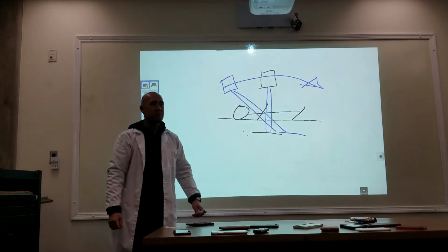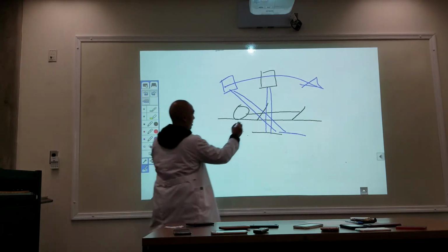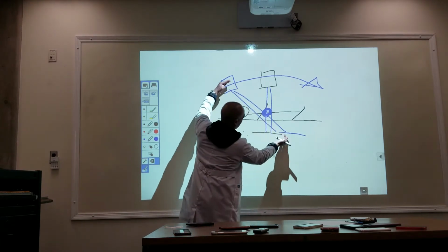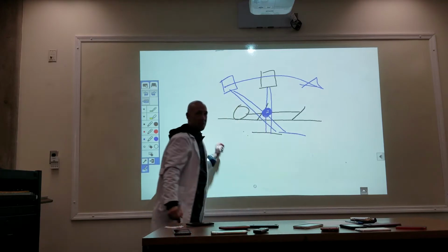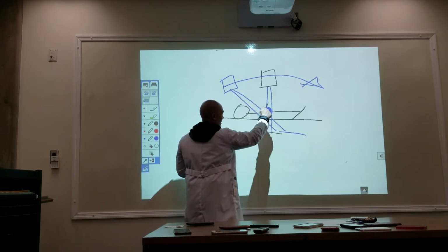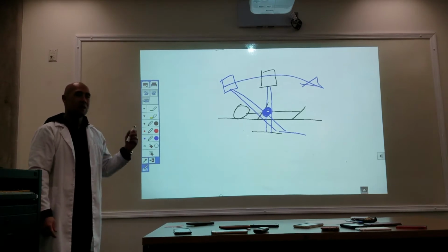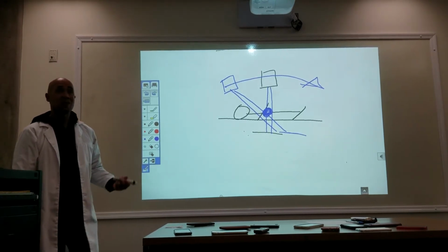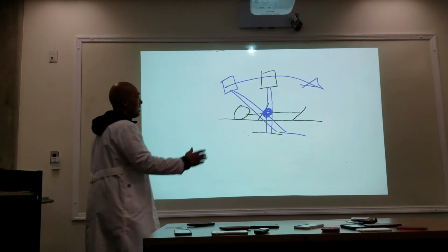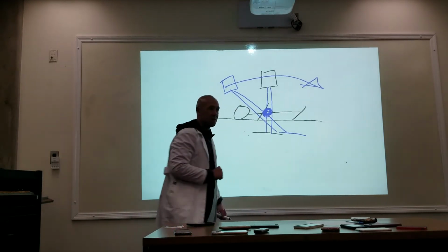opposite direction. The X-ray image that you get is blurred, except at the fulcrum, the point, the center of this X-ray tube and the Bucky is your fulcrum. So anything above or below that image, except at the center of the fulcrum, is going to be blurred. It's called a tomogram. There's a lot more to it than that, but we don't have time. Okay? So again, you're taking an X-ray. We call it a sweep. When you make an exposure, the X-ray tube sweeps across.